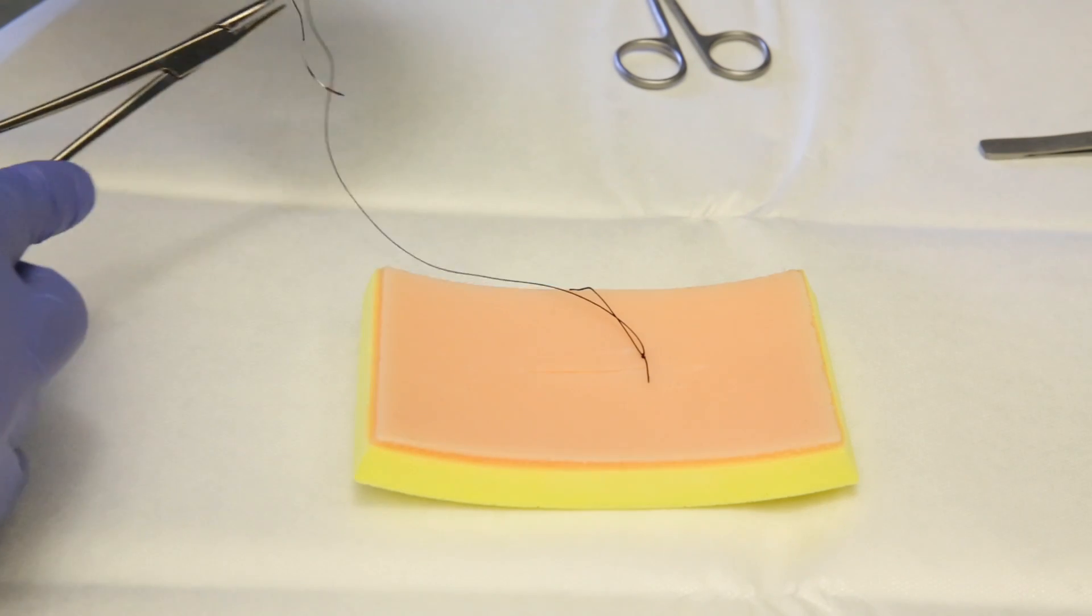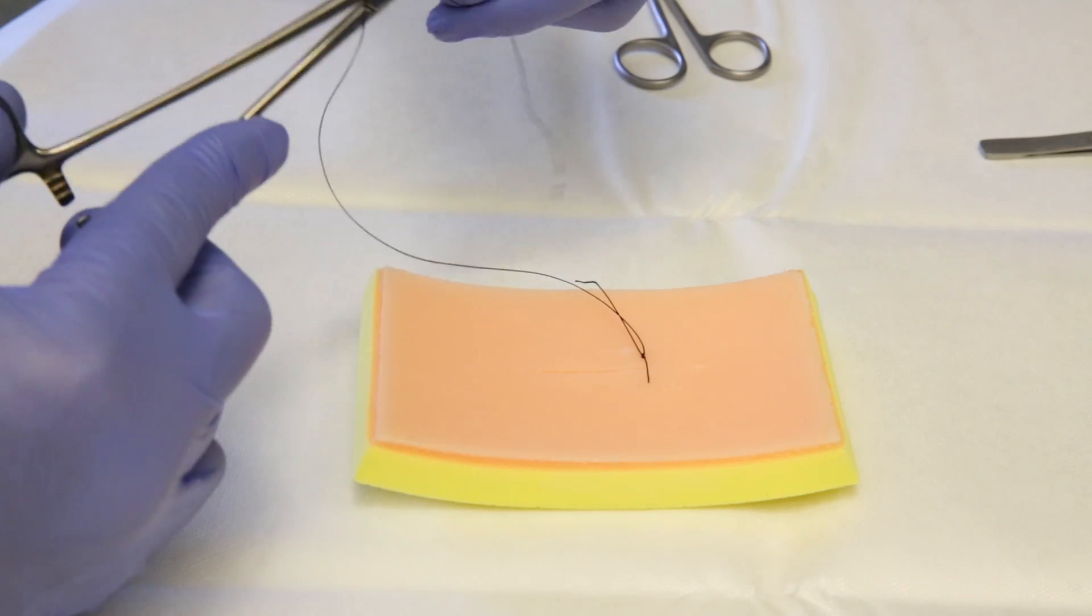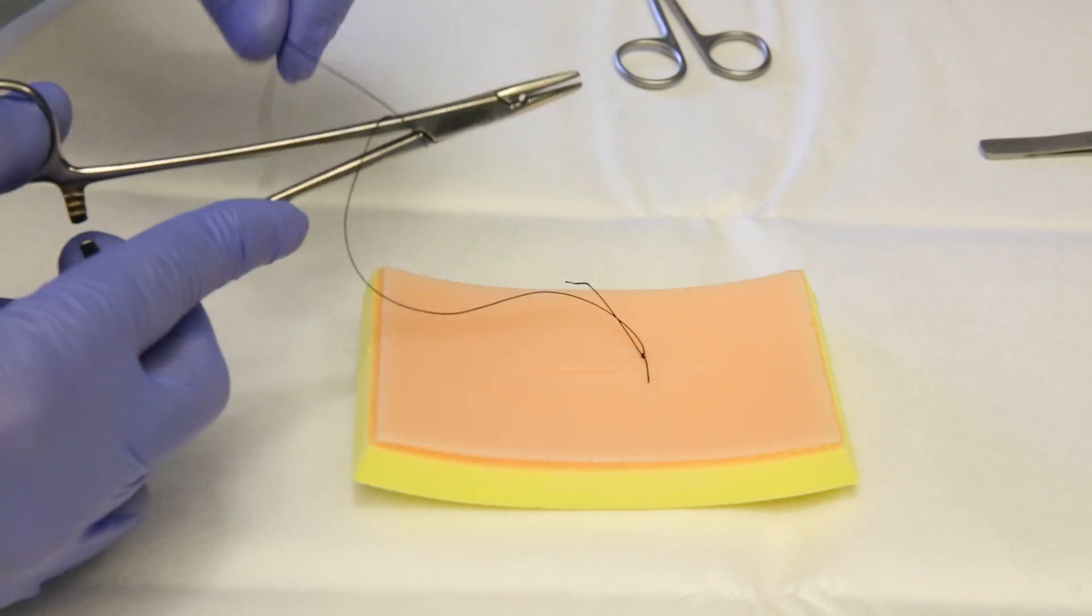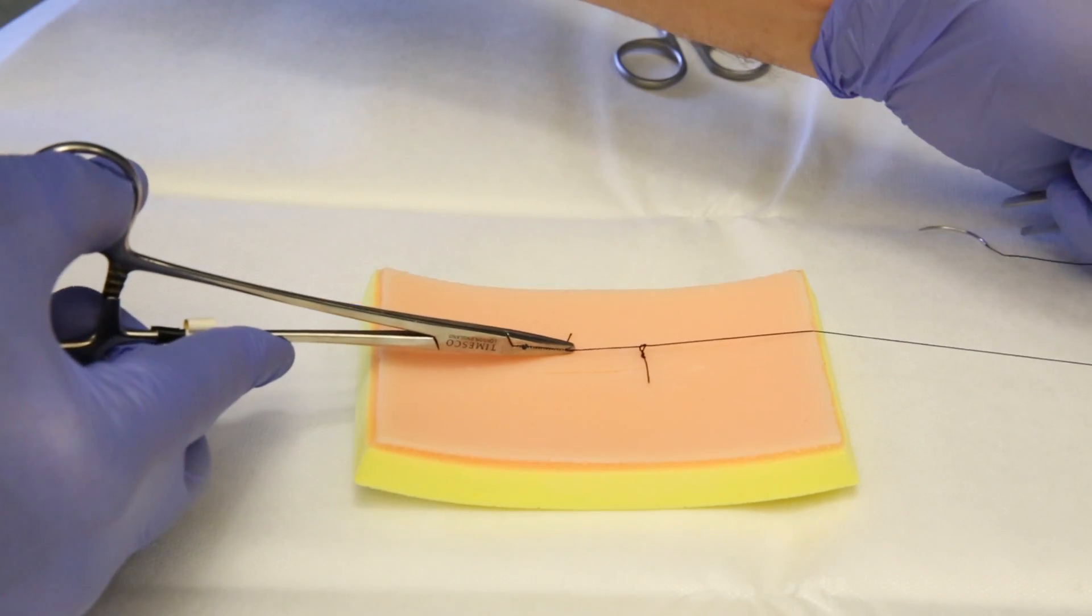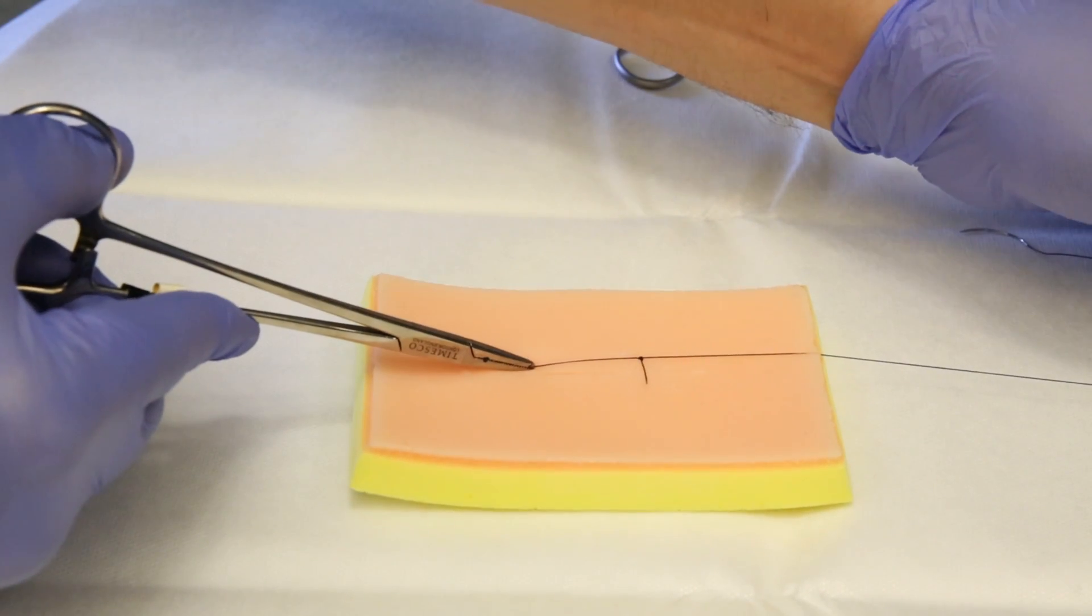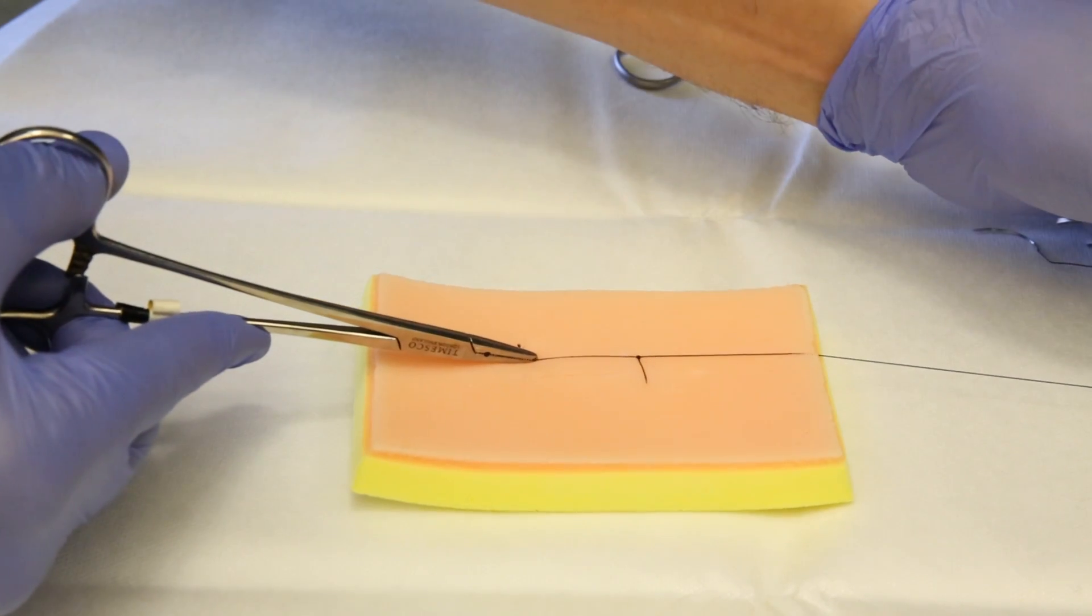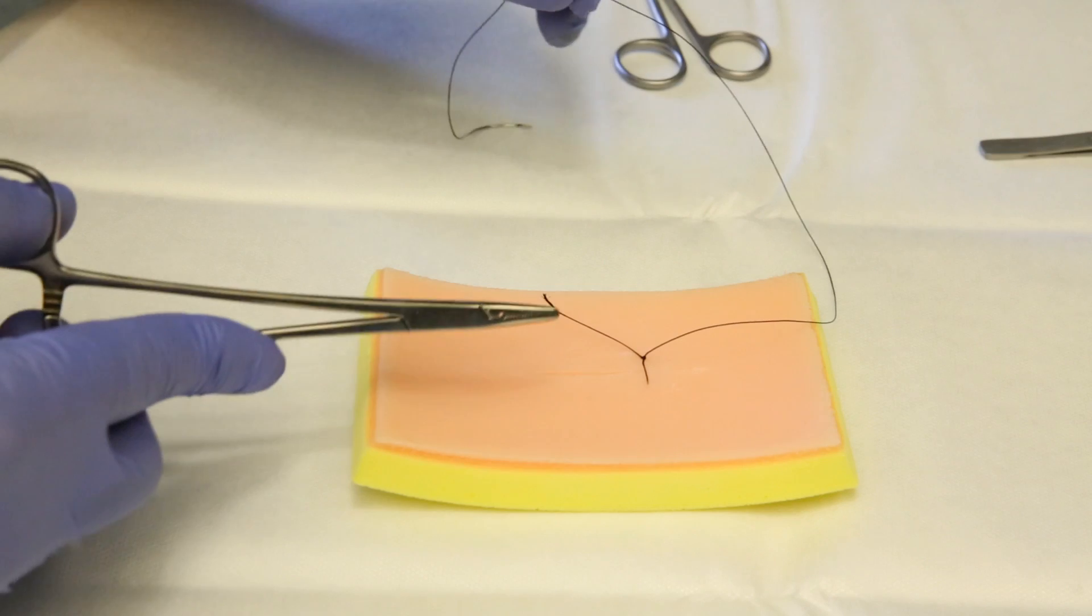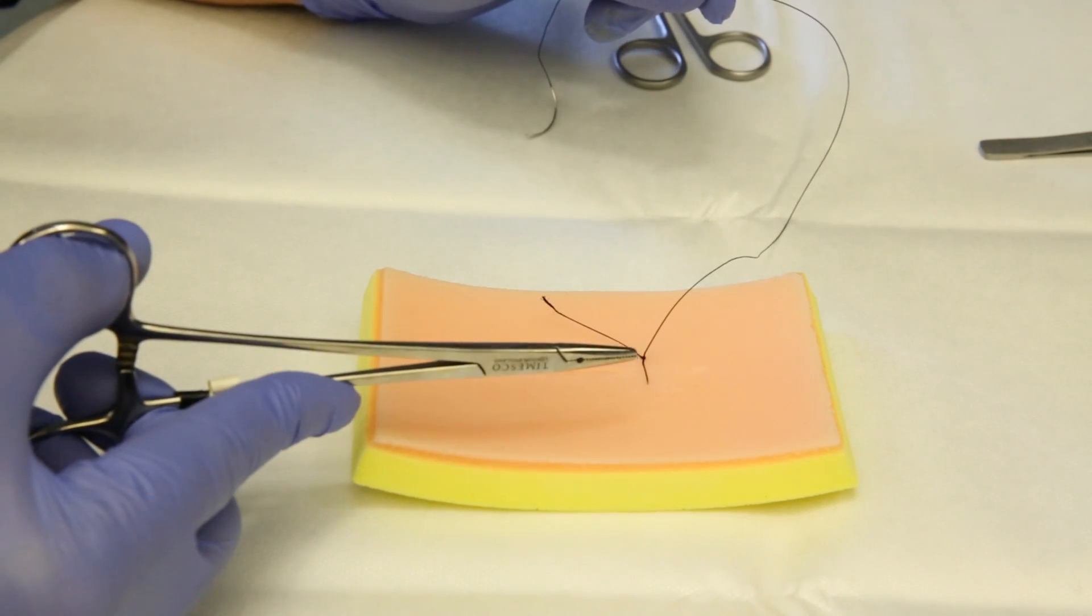Now, in order to secure this knot, then we make this time only one turn, taking the end and stabilize our knot here. We avoid excessive tension. The tension you need is just to approximate the wound margin together.